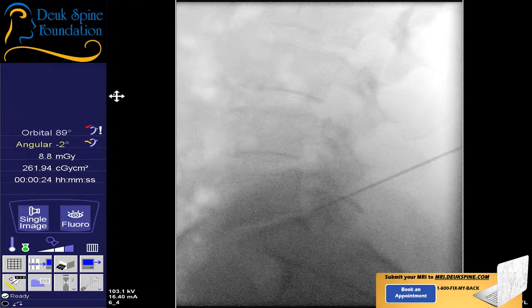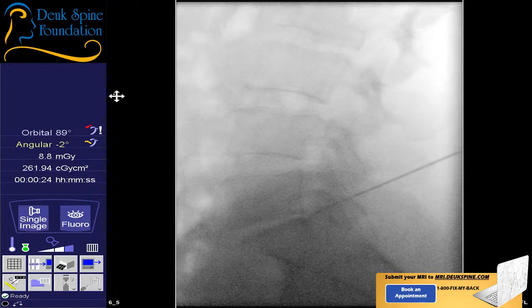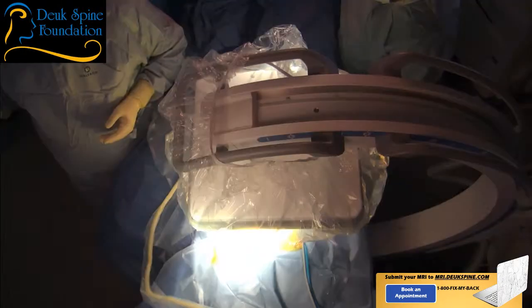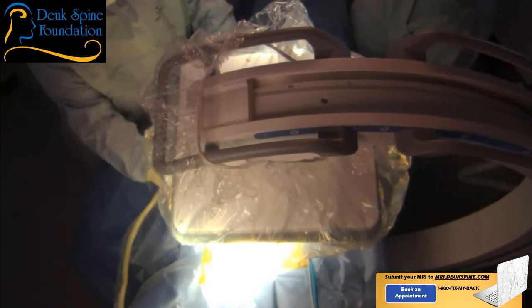Are you awake? Let's go, let me get a little bit closer. Where do you feel that? In your back or your leg? In your back. All right, AP. So that's perfect. Couldn't do better. She's not jumping around or moving, but she's still responsive and she can give us accurate information. So for those of you watching the surgery for the first time, we do need our patients awake in the beginning.